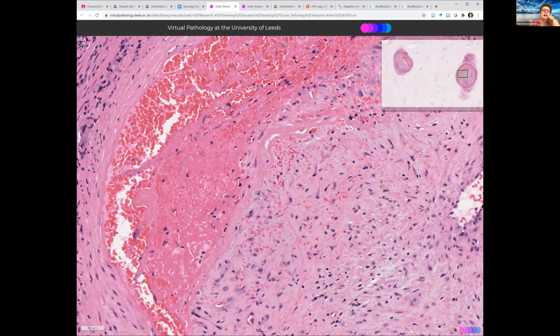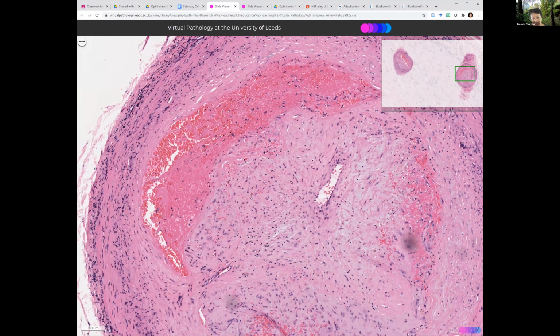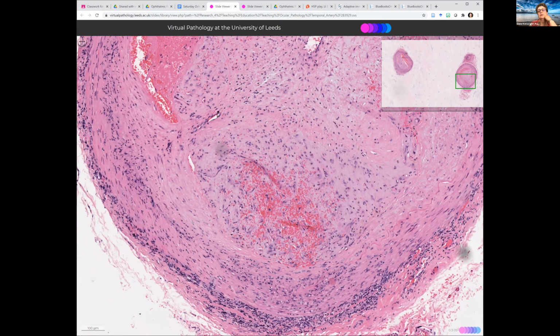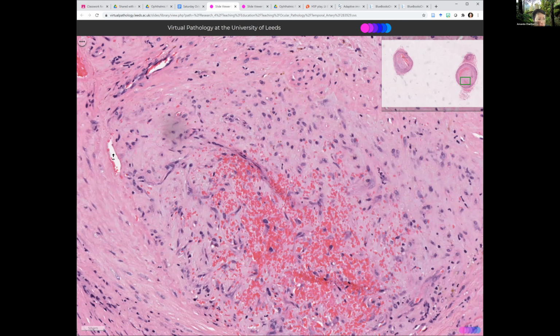I agree. I think that down here is in a vessel that's actually thrombosed off, and most of that stuff in the lumen is organizing thrombus, and we've got a little neo-lumen that's formed. Yes, neovascularization here, here, this little slit-like thing.